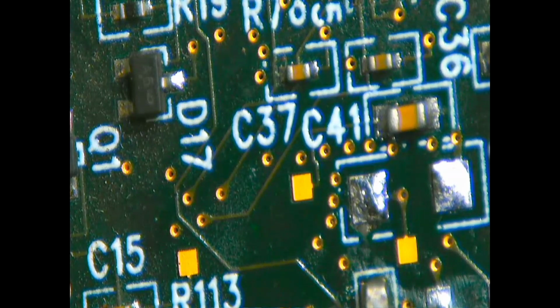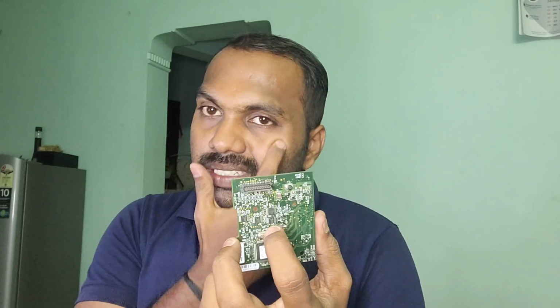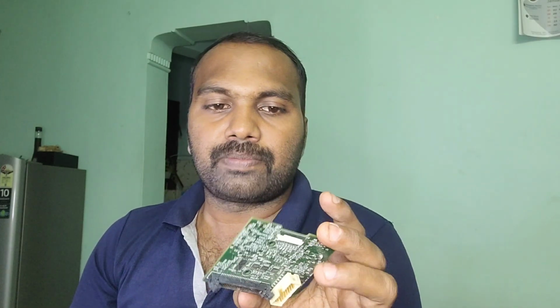Hope you like this video. Let's see. So that's it. The board has been repaired, and we saw where the problem is, a bad capacitor. I need to order that one today itself. If the same capacitor is available in the market, we can arrange it and send it to the customer.